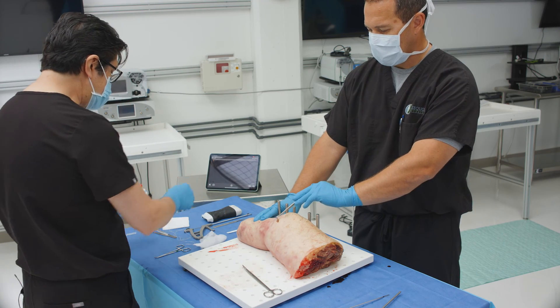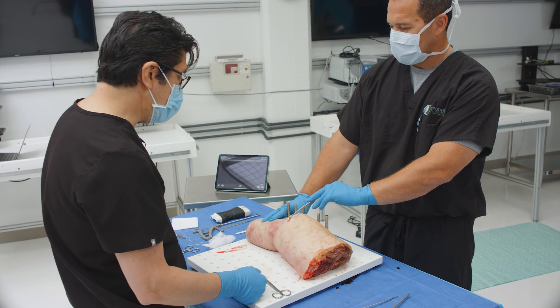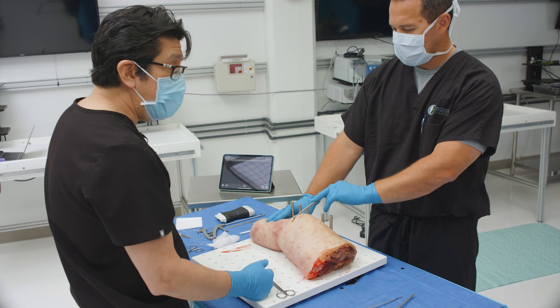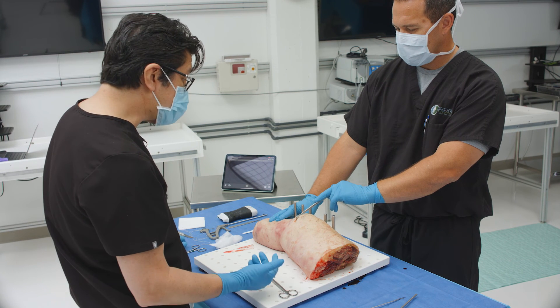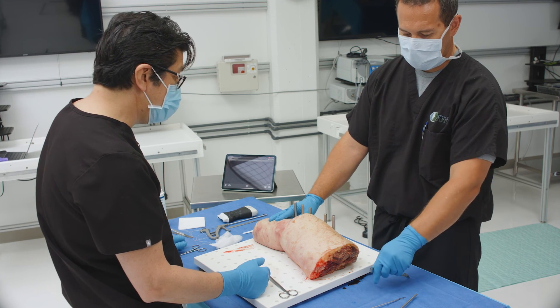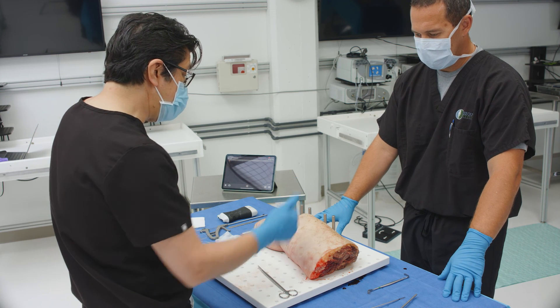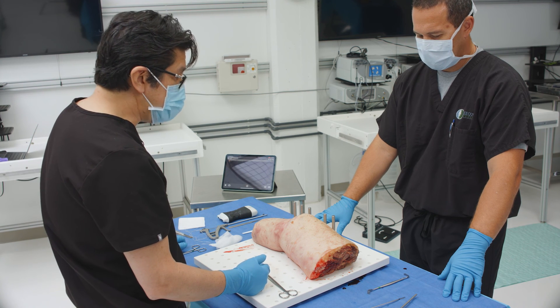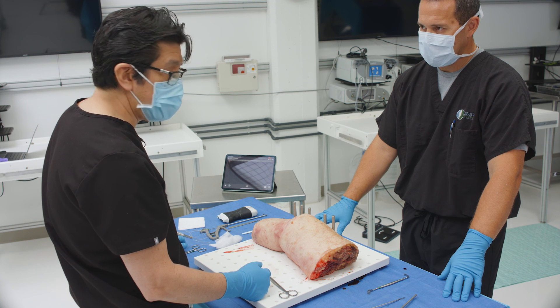What this technique does is negate the need to use any other technique to isolate the actual insertion point of the MPFL on the femur — so there's no guessing. We make this anatomic, unlike other techniques, specifically the one promoted using fluoroscopy, where identifying it is much more difficult with more potential to miss the spot. This could easily be done for the patella as well, and for reconstruction — not necessarily just repair. This simply localizes and identifies the exact anatomic location so you can do your repair or reconstruction of the MPFL.